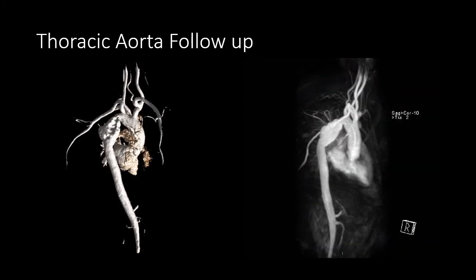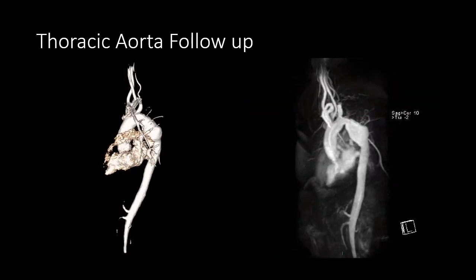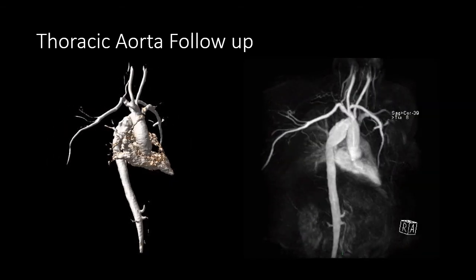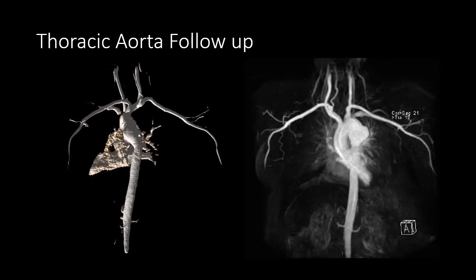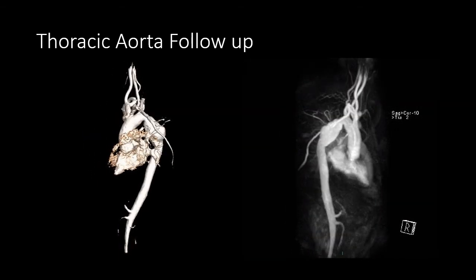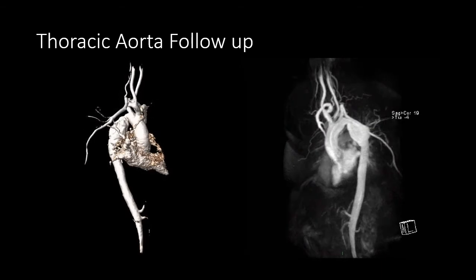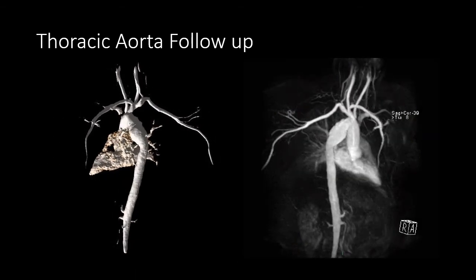Now, for the thoracic aorta follow-up, MR gives us some really good options. This is a woman with a stable aneurysm of the descending thoracic aorta. She's been imaged every year or so for about 10 years, and this has been completely stable, so we haven't done anything to intervene on this. She doesn't need it, but MR provides us this reassurance that it isn't getting any bigger without using ionizing radiation.